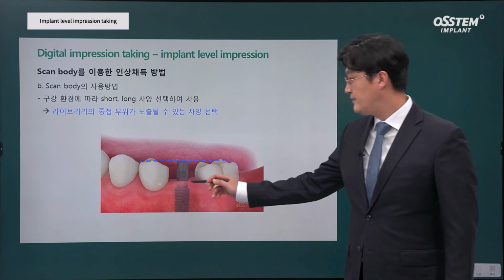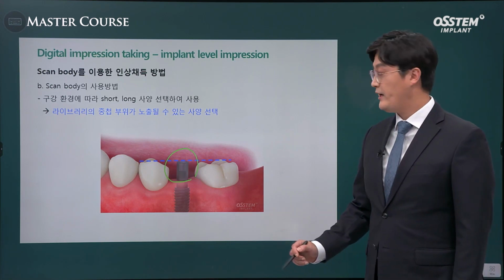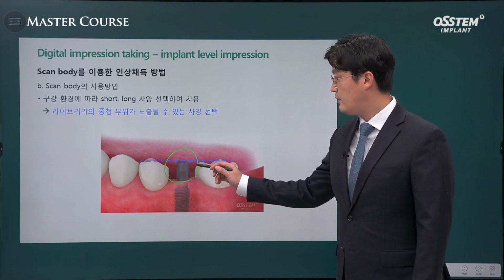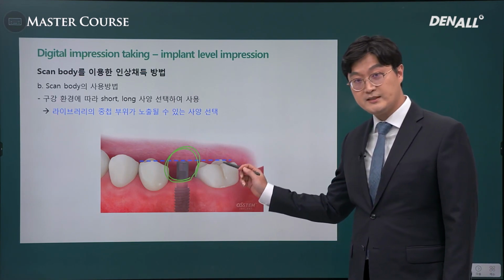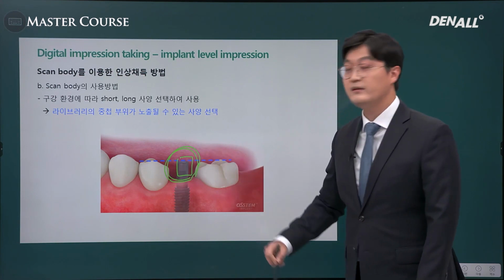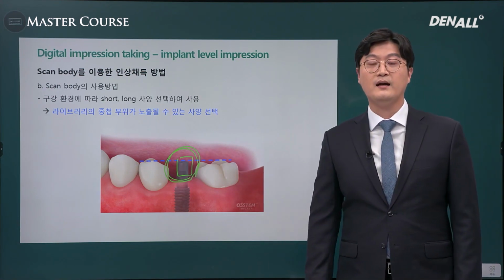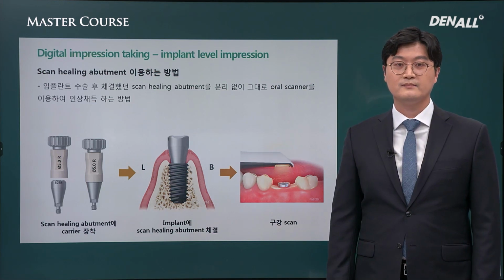A scan body is selected and inserted for scanning. Later, in a CAD program, the scan body and the CAD library need to be merged. Based on this portion, only this part needs to be merged, and that portion only should be exposed above the gum.